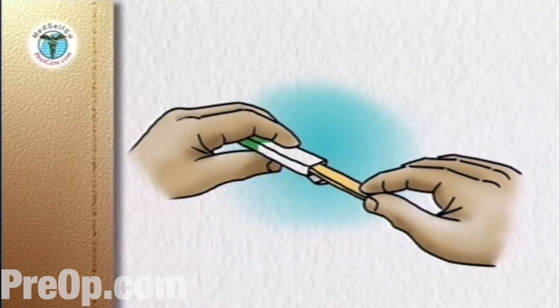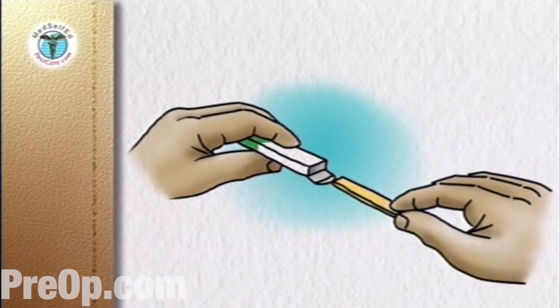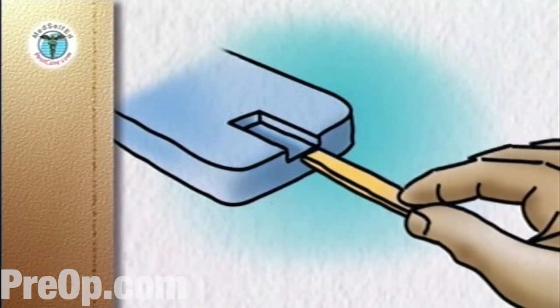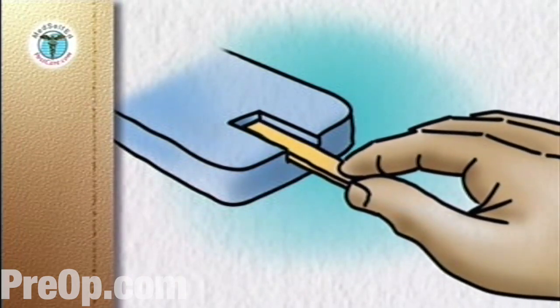Remove the test strip from its individual package. With the meter off, insert the correct end of the test strip into the test slot of the meter according to the manufacturer's instructions. This usually turns the meter on.